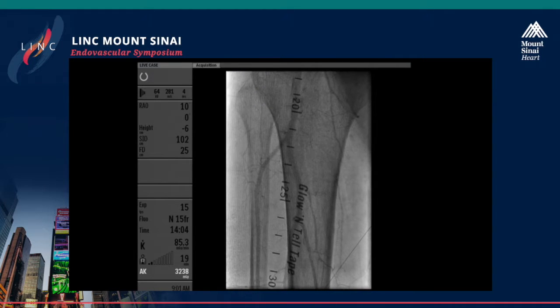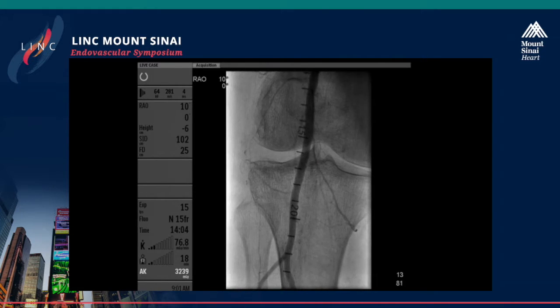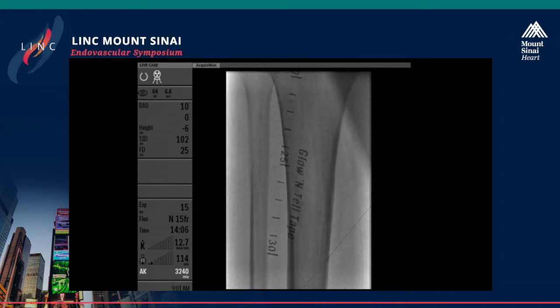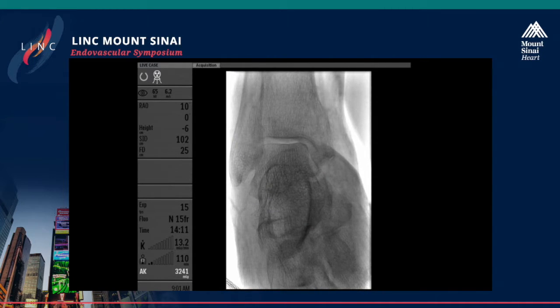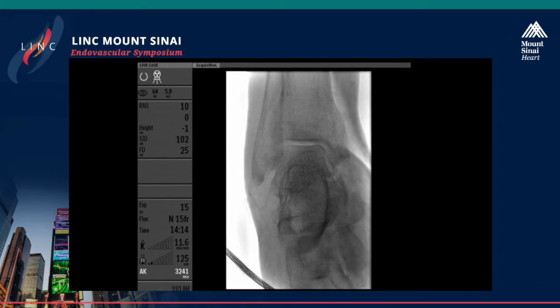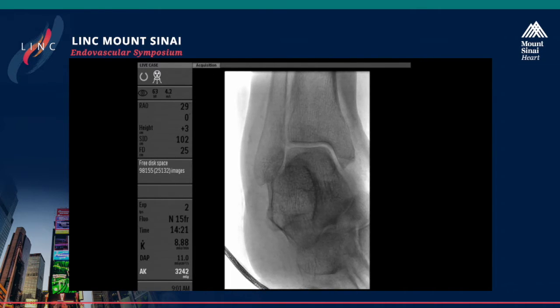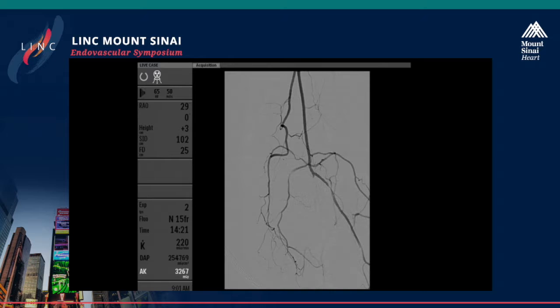I'm not sure actually that a drug-coated balloon here, we're all going to do that, of course, but there is no data that it is better than plain balloon angioplasty after directional atherectomy. We also published a series of patients treated with directional atherectomy and plain balloon angioplasty after angioseal complications, with follow-up of 16 months with perfect patency rates. So I'm not sure how much difference the drug-coated balloon will make, but we feel that it's probably better than plain balloon angioplasty, though there is no proof yet at this time. Well, this patient would be excluded from every trial.